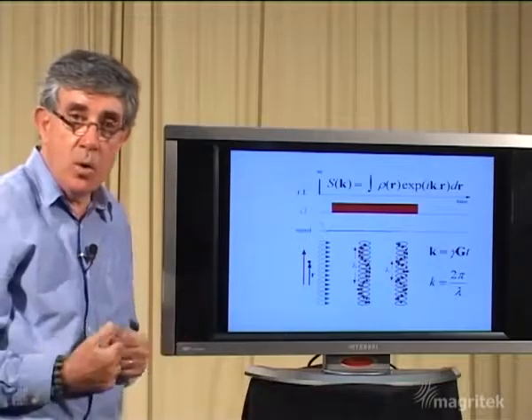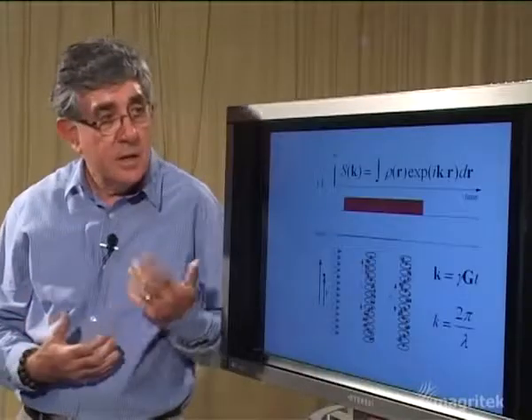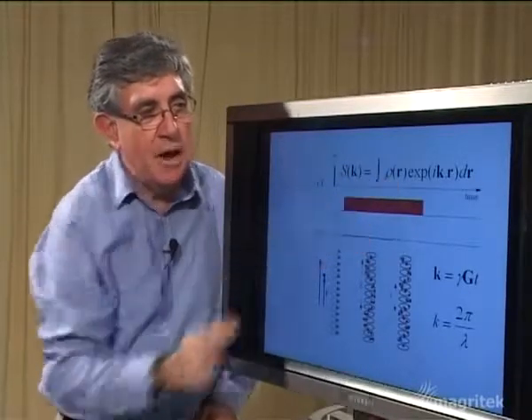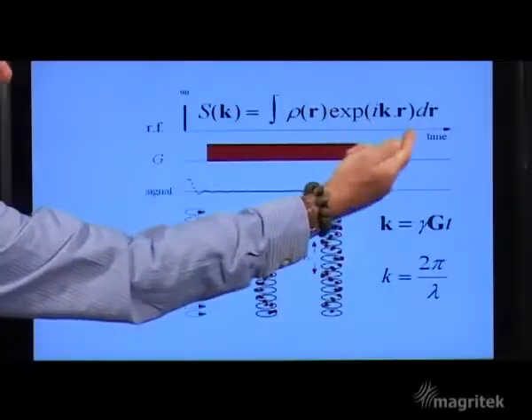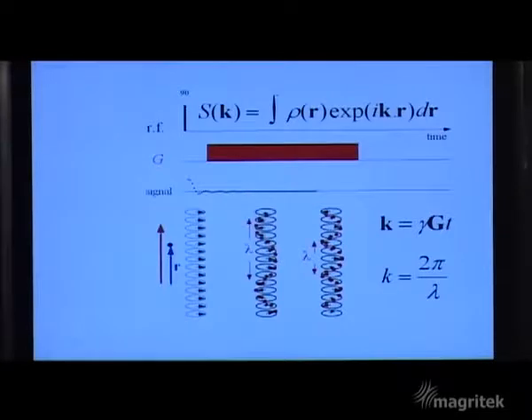And of course the signal we acquire at any particular time is, as before, this Fourier relationship between the signal in K-space and the spin density now represented at particular positions in 2 or 3 dimensions. Again with the phase factors involving a dot product of the wave vector K and the position vector R.